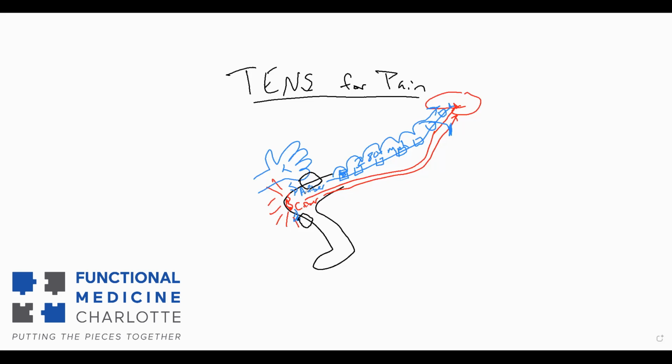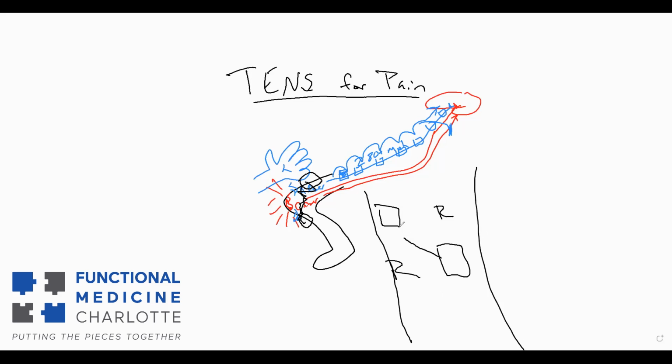So you can basically cross the joint with the pad, so you're getting electricity crossing the joint. So you don't necessarily need it to be on the pain spot for it to be helping the pain spot, because the electricity isn't only under the pad. Like there's communication. So some units have 4 pads, and so 2 of them are red and 2 of them are black. So if it were a person's low back, you might set it like this, so you get cross stimulation. So you're actually treating this whole area, not just where the pads are.